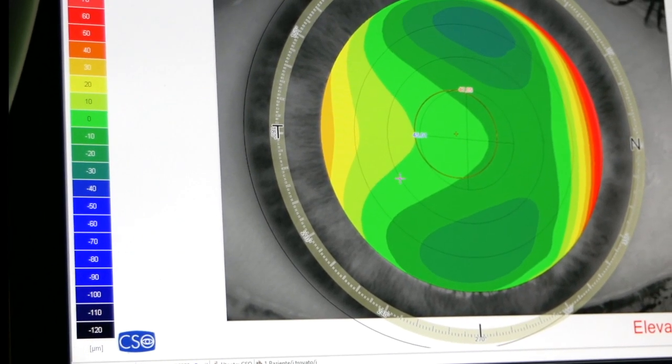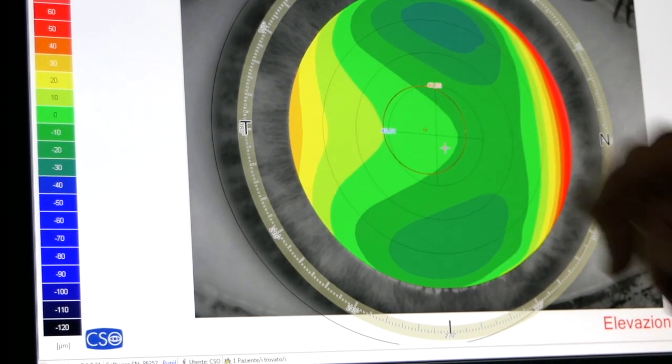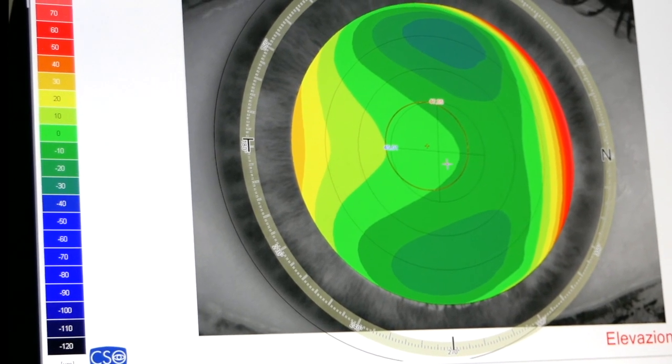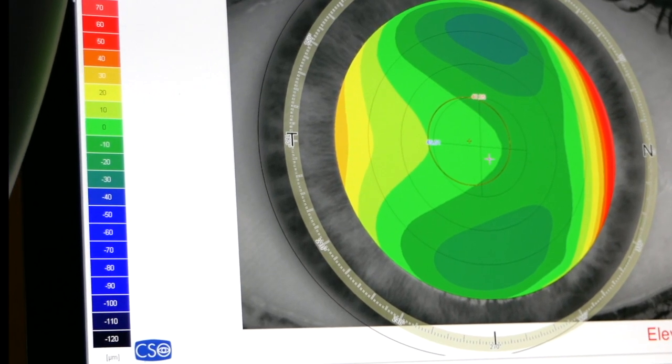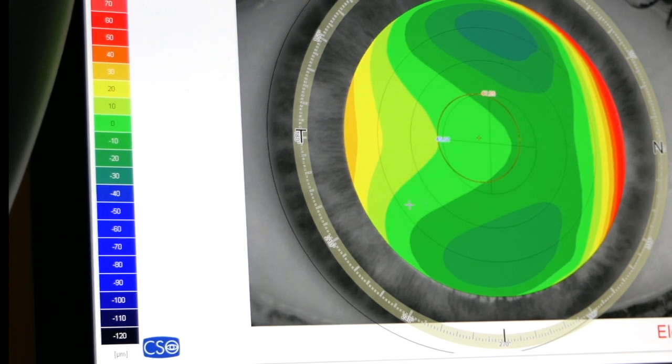It puts this sphere ideally resting on the cornea and draws everything that comes over the ideal cornea in red colors, and everything else that comes under the ideal cornea in blue values.